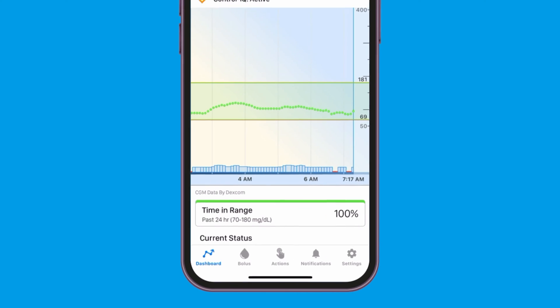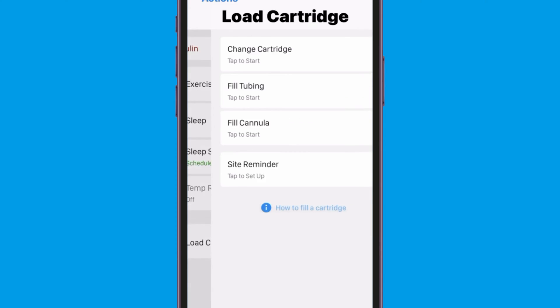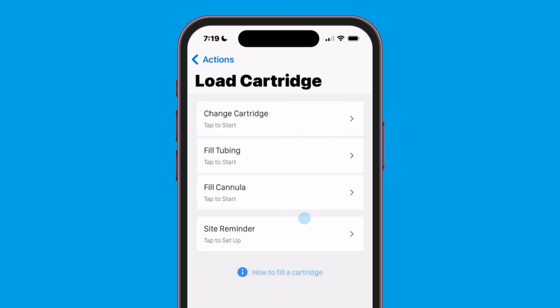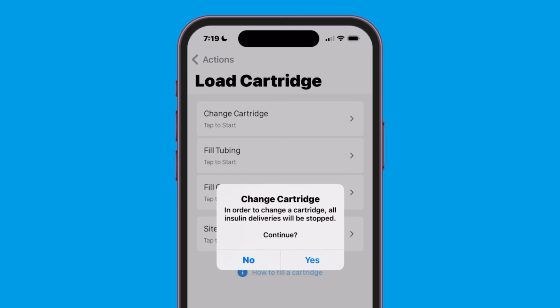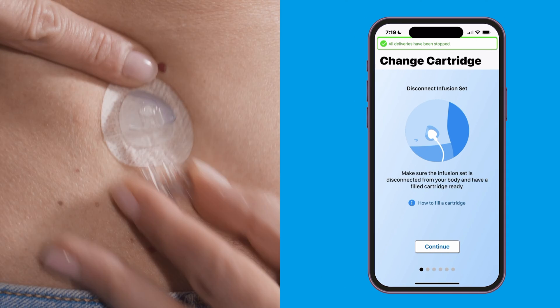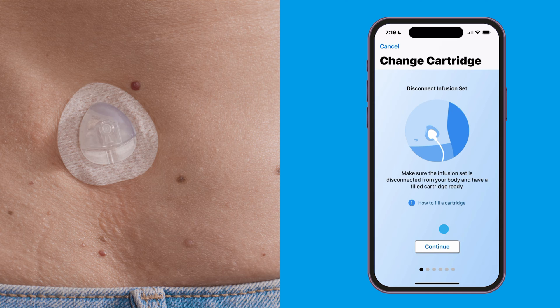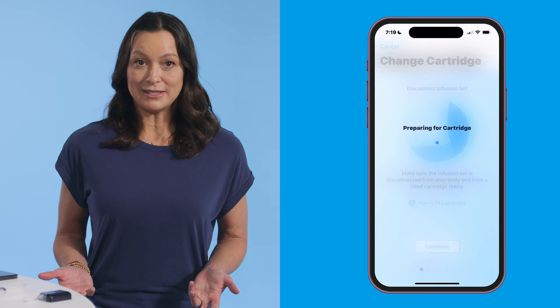Now it's time to install the new cartridge. Open the Tandem Mobi mobile app on your smartphone. Under the actions menu, tap load cartridge, then tap change cartridge. Your phone security feature will pop up to confirm the request, followed by a screen to notify you that all insulin delivery will be stopped. Tap yes to continue. Next, disconnect the infusion set from your body and tap continue. It's very important that you're not connected while starting this process.